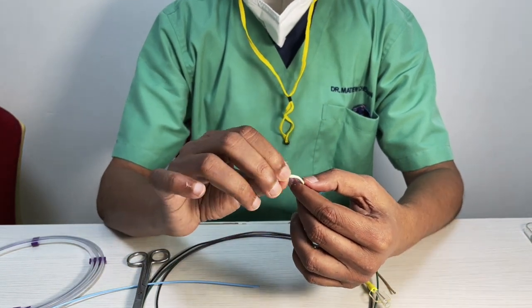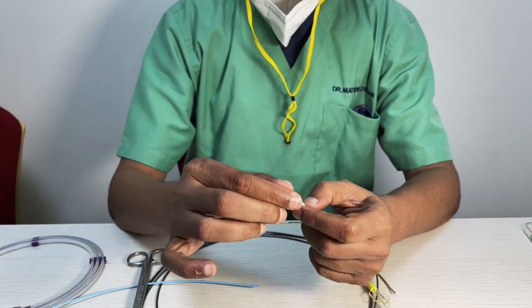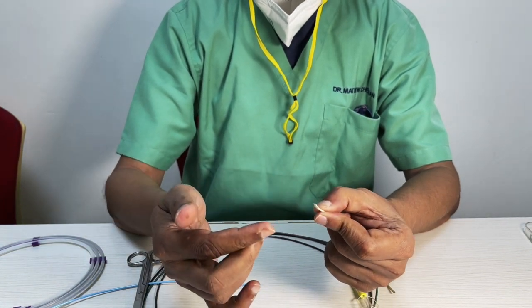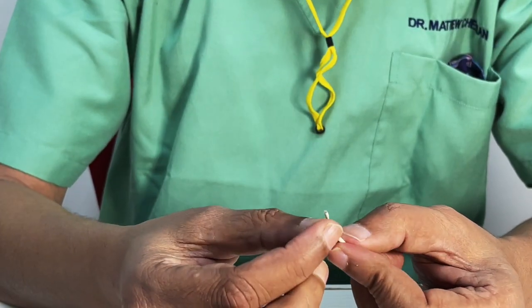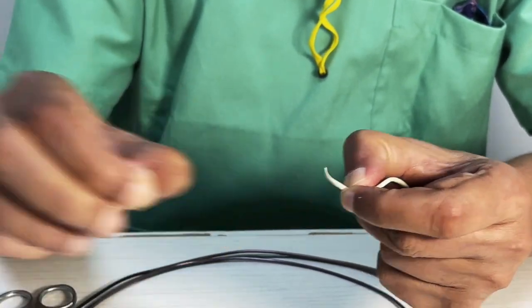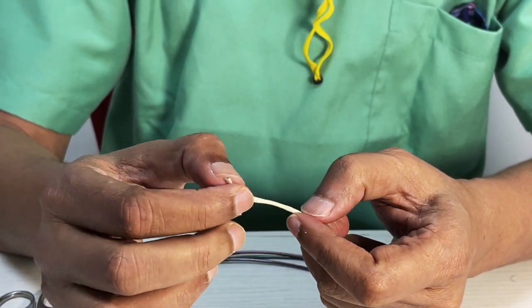When you come to this part, you can actually see the tip of it will have nothing. It will break in your hand. You can see that here. The tip just came off into the hand. So there is nothing here. But beyond this, there is actually a coating they use to make it soft, and the braiding starts actually stopping towards the end.